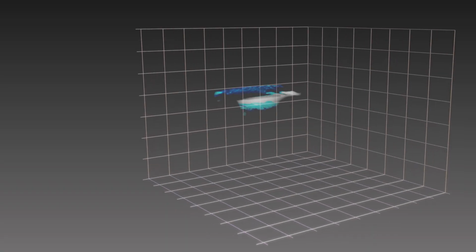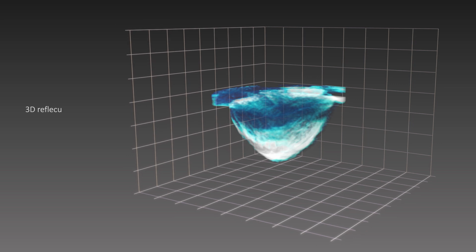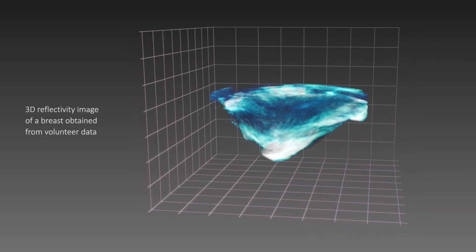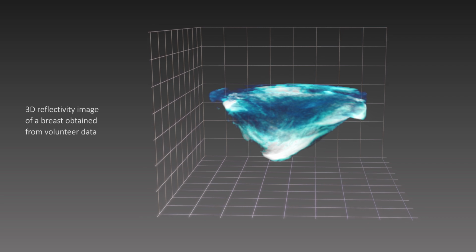And by minimizing those differences, by making our simulations closer to the actual recording of data, we can reconstruct a better model of the human tissue. And that model is what eventually we call the image, and what radiologists can later on interpret as medical images of an arbitrary kind, as they do with mammograms or with MRI.